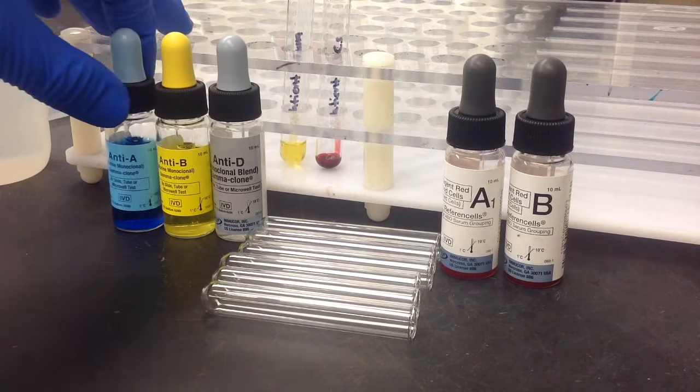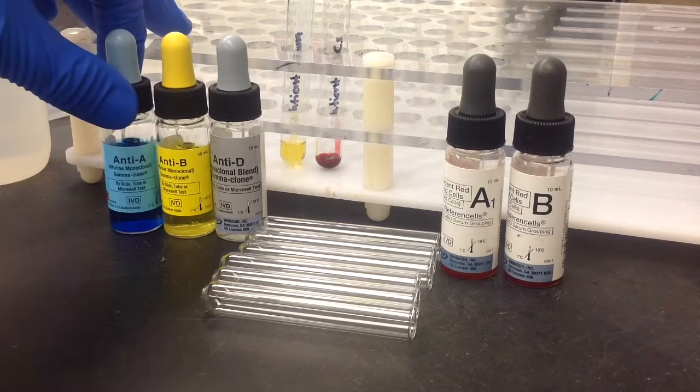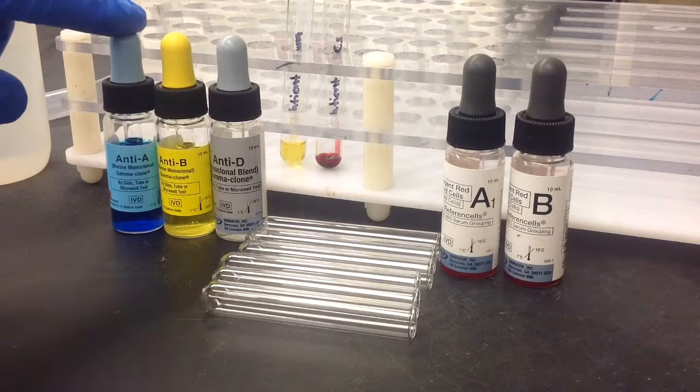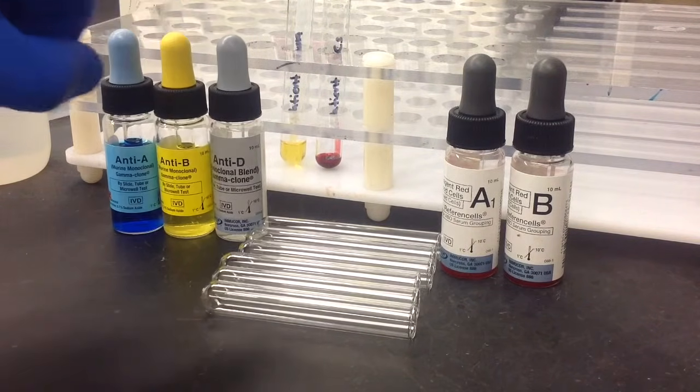In this video, I'm going to show you how to do a forward and reverse ABO/RH type. First thing you're going to need for your forward is your anti-sera: your A, B, and your anti-D.